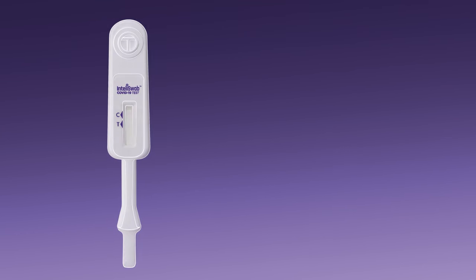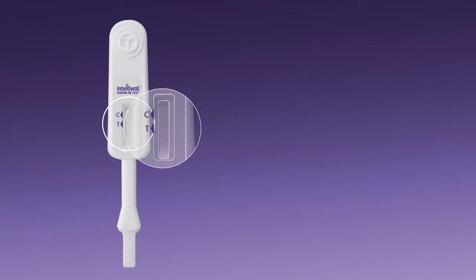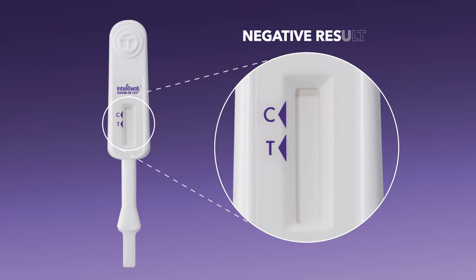Now, let's take a look at how to interpret your results. Your test is negative if there is a reddish-purple line next to the C and no line next to the T. There must be a line next to the C to be able to interpret a negative result.